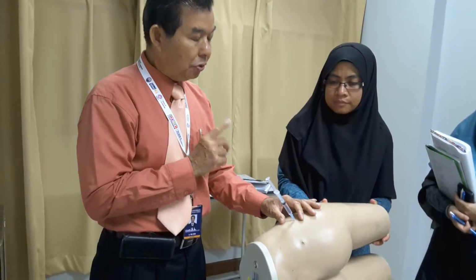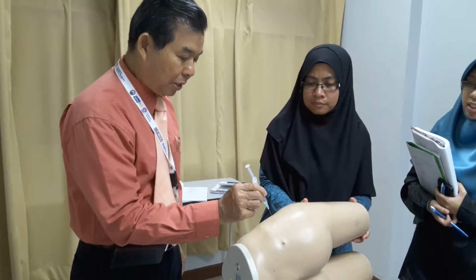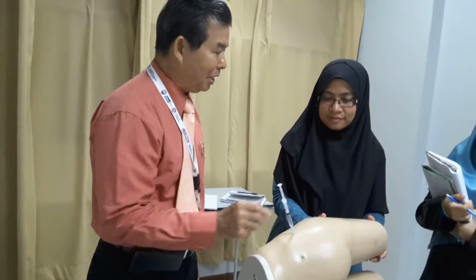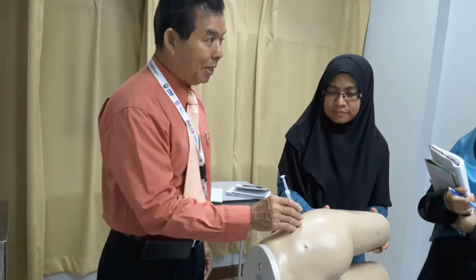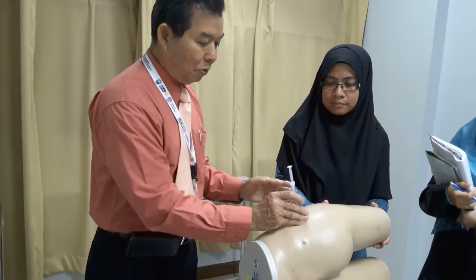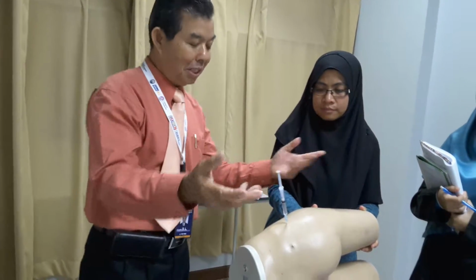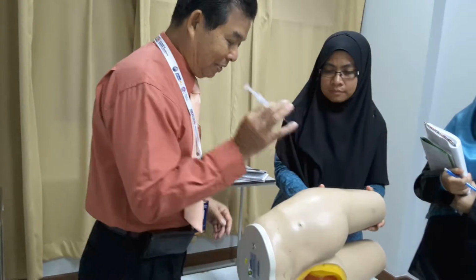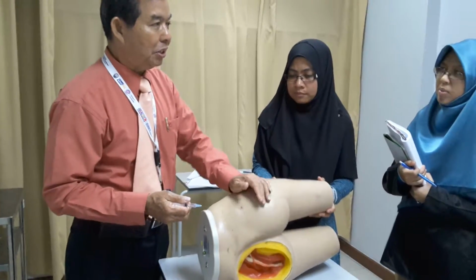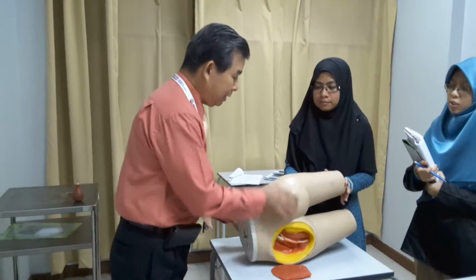But what you should know is, the pain is when you are touching this needle to the skin. Or if you keep it there, it is paining all along, isn't it? Okay, puncture it, not much. When I do it, I adjusted already. 1, 2, 3, 4. Okay, perpendicular, well adjusted. Never mind, whether you want to do it or not, your choice. Okay, done already, you injected already. Afterwards, we pump and then sometimes we massage. Okay, this is IM injection.